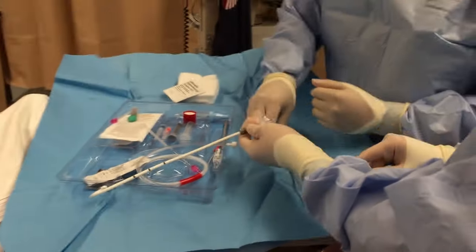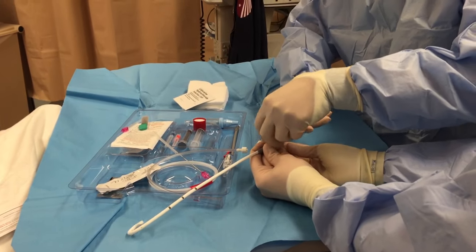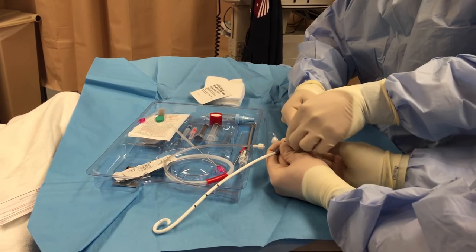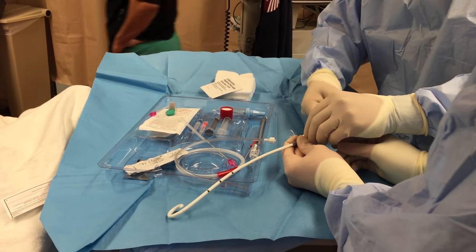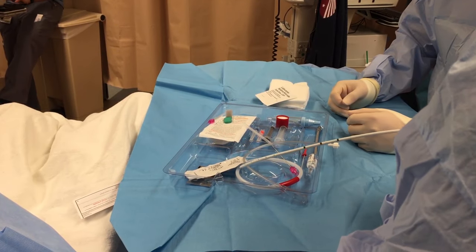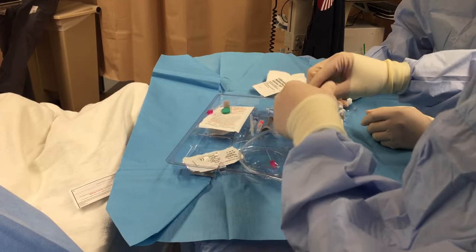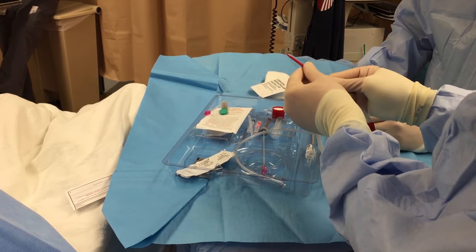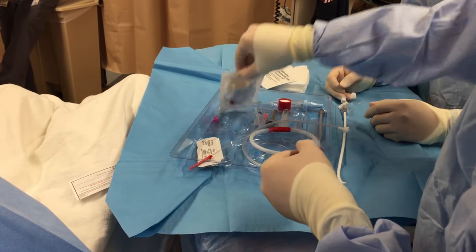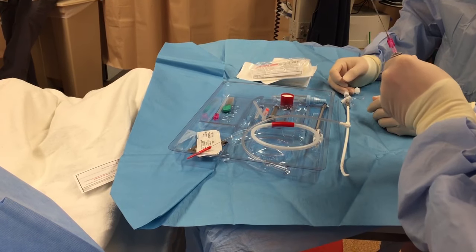So what you're going to do is insert the internal dilator into there, and that's going to straighten out your pig. Now it locks. You've got your wire. The wire is super easy to kink on this kit, and the dilator is super easy to kink, so I will show you the trick when we get to it to help prevent that from happening. We're not going to use that whole needle.